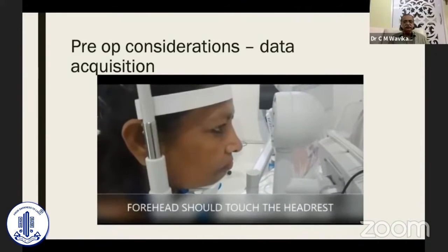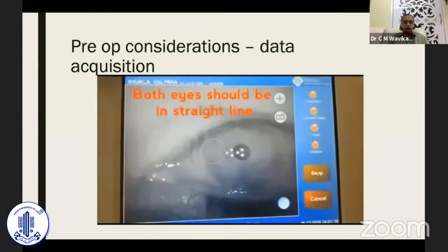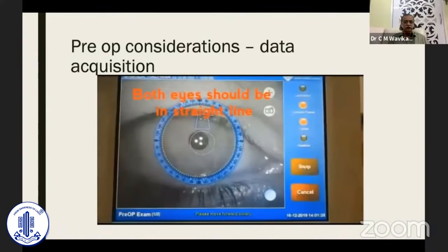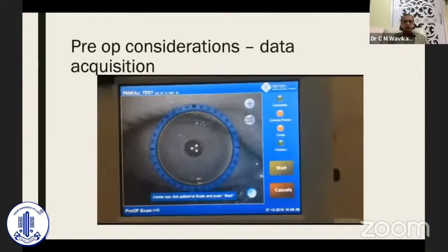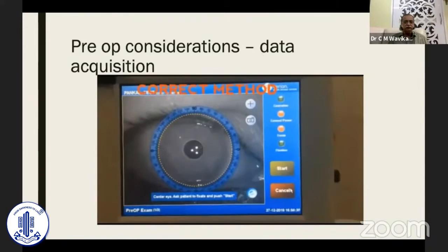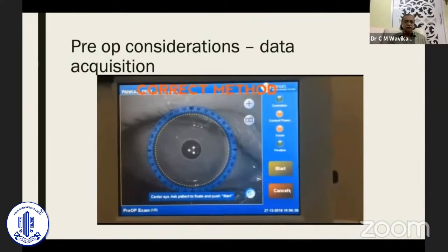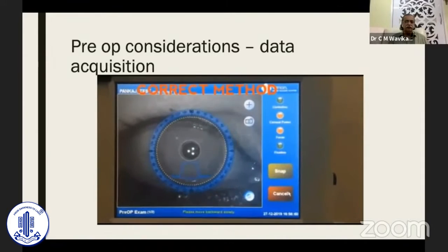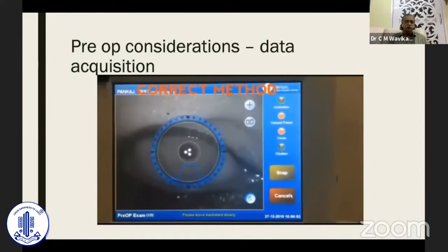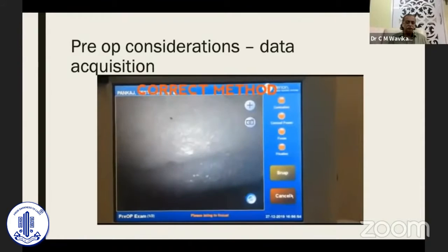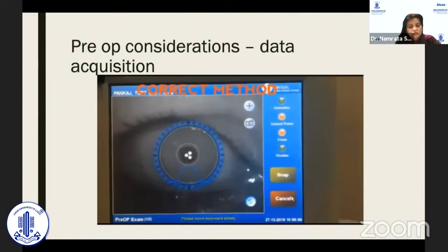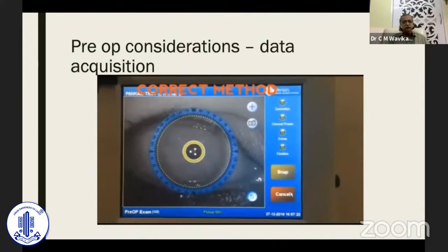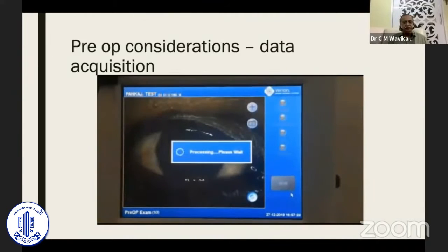The lateral canthus should match the black mark on the sidebar. The forehead should also be touching the headrest. Move the machine from one side to the other to ensure that the eyes are in the correct horizontal position. Ask the patient to blink frequently. The blue mark means you are taking the K reading. Move the joystick slowly to and fro until you get a correct reading.